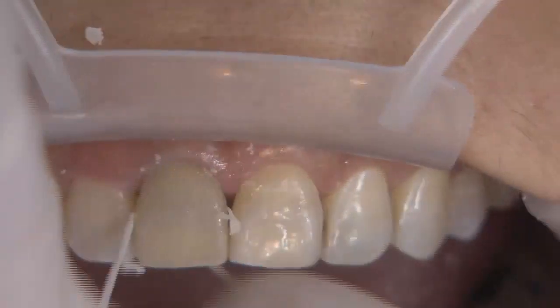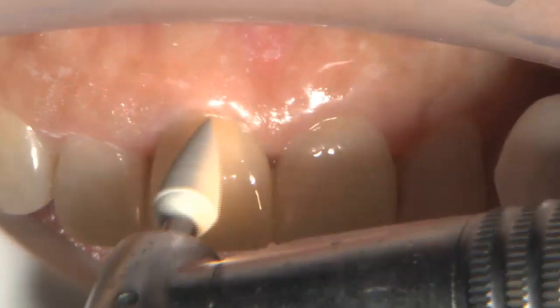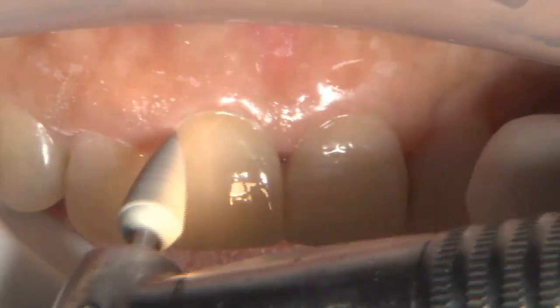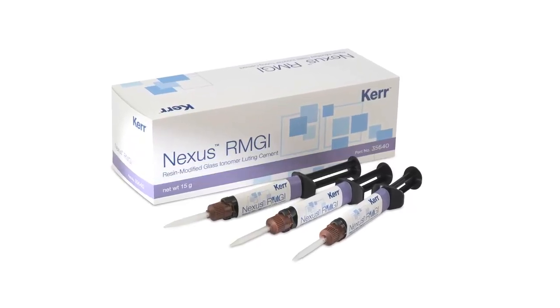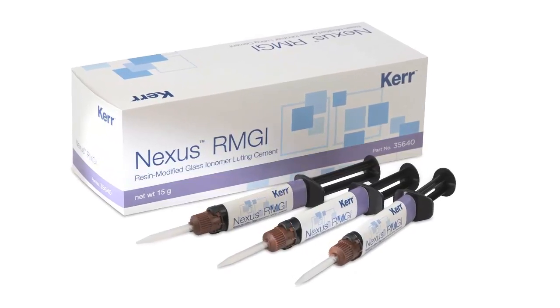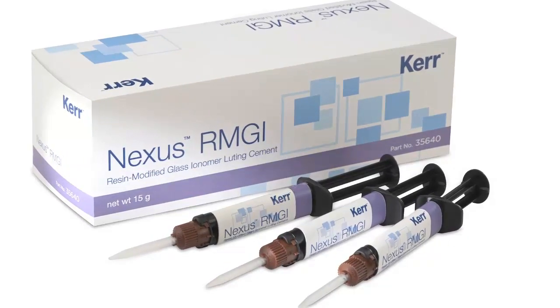As you can see, it cleans up very nicely as well. I'm using some super floss — you can see that thick little portion that does such a great job of picking up all those extra pieces of cement in the approximals — and then a polishing tip to go in and smooth off any little pieces that might be at the margin, or if we need to put a high shine on that restoration in the gingival third. And there it is, cemented into place with the Nexus RMGI. The ability to peel that off in one piece is a big advantage of this material, and with the Nexus adhesive chemistry that many of us have come to know and trust, it's a really confident feeling and a simple, straightforward cement to use.